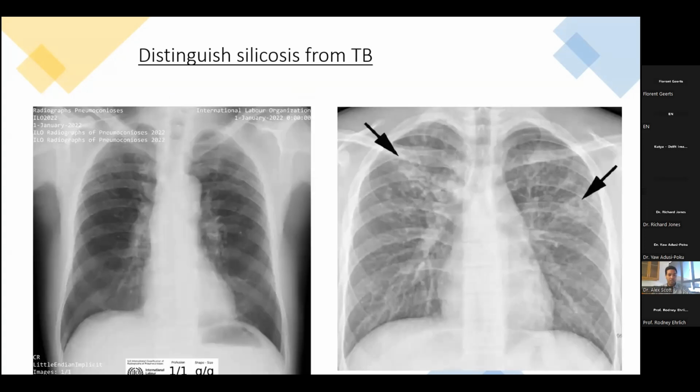But that's not usually the problem. Next slide, please. So now we have to distinguish silicosis on its own and silicosis from tuberculosis. On your left is an International Labour Organization standard film, which is distributed for people to use to calibrate their eye. That is a difficult image. It's a digital image. You're probably reaching forward to your monitors now. You probably can see that there are nodules, but maybe not. Could it be TB? So the beginning of the problem should be dawning on you.